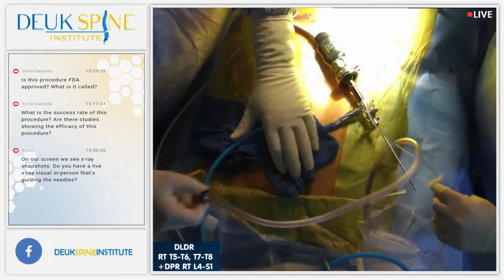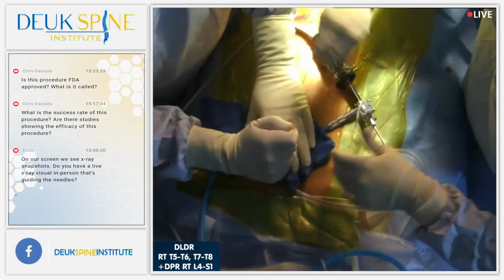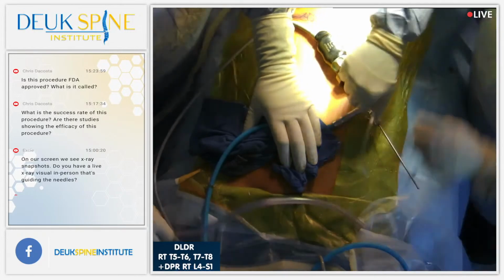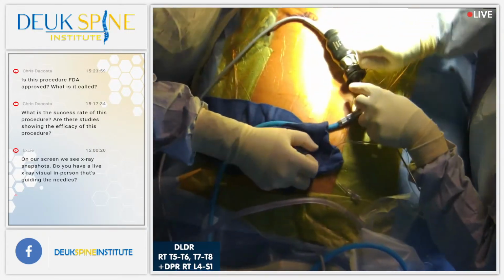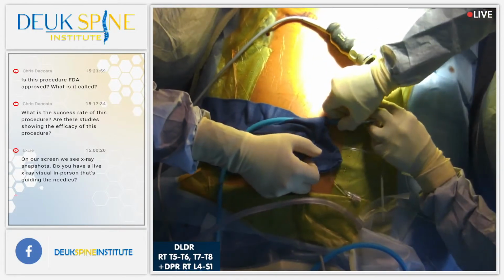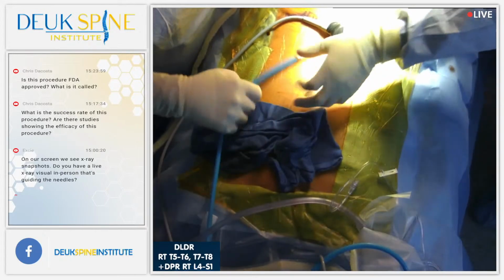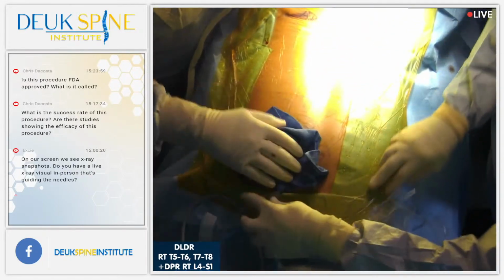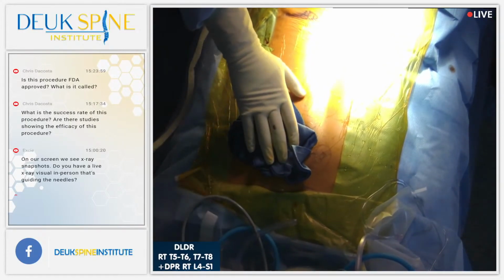They use an RFA rhizotomy. We don't do an RFA rhizotomy. We do a plasma rhizotomy, which is a new technology we developed here. And the plasma is more powerful. The problem with the RFA is it doesn't work. It's not enough energy, and it's directed at one single point next to the spine where the doctor hopes that the pain nerve actually is. But a lot of times the nerve isn't there. And the treatment doesn't work because it doesn't deliver enough energy to that nerve.